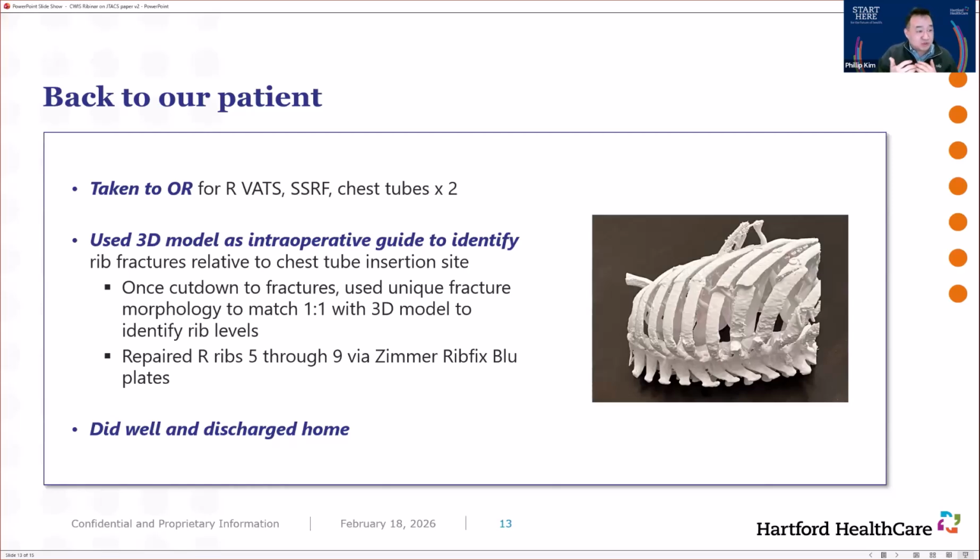Obviously, there's a chance that fractures do change over time from the CT, but for the most part, they stay relatively consistent. That's one thought. Another thought is to automate this process for surgeons, so that I can make this a button for you to print directly to the printer. I think that would be amazing. That's one of my hopeful goals. I'm collaborating with some engineers on how to do that, because I think that'd be a huge service for the community.